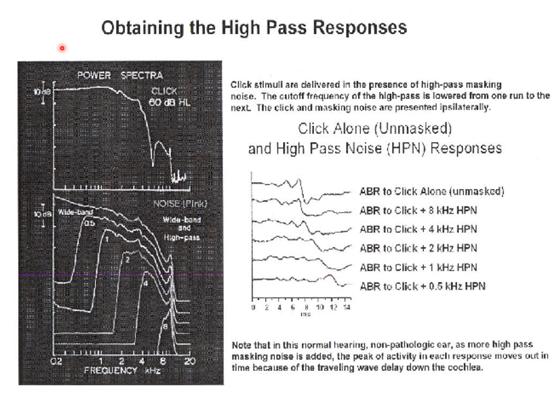So this figure is one I copied from a book. It's showing similar ideas. Here you can see we have the ABR waveform obtained by using clicks alone, just clicks, and we have wave V here. Pretty good looking.